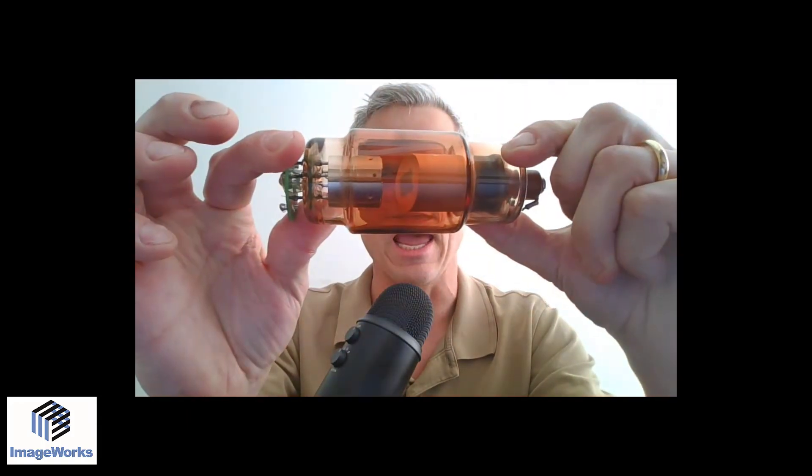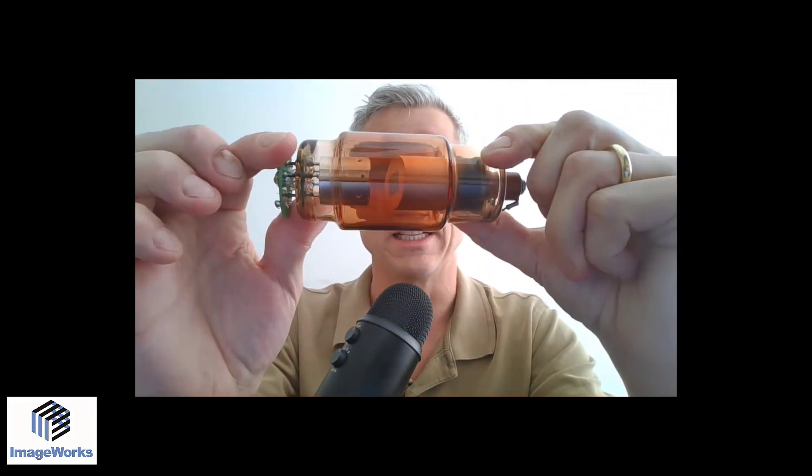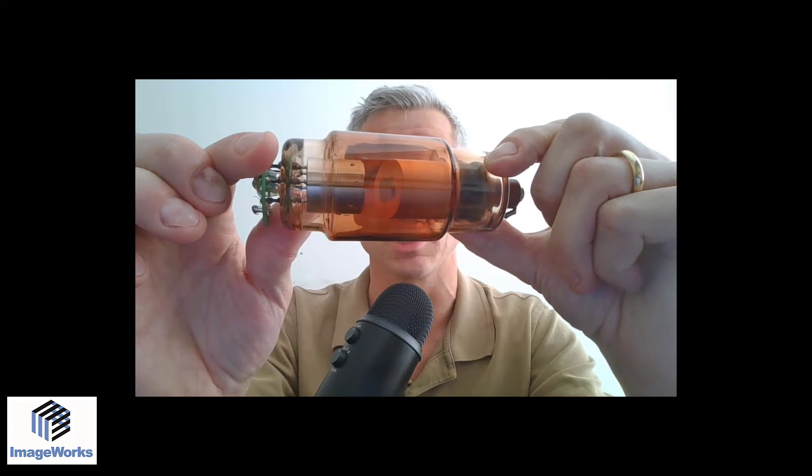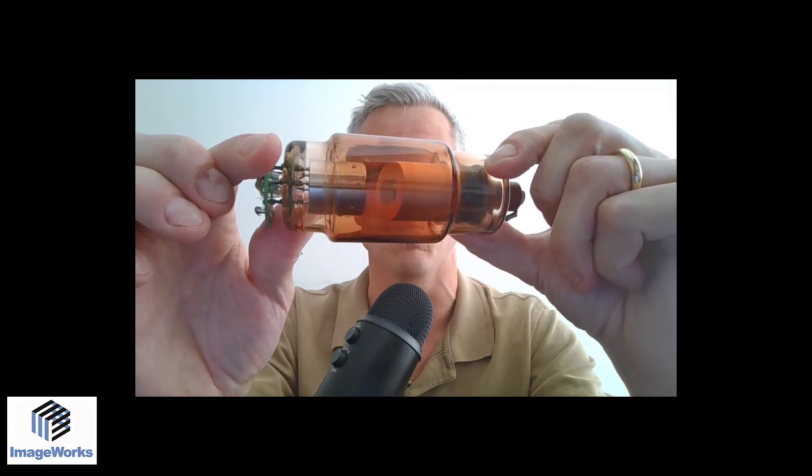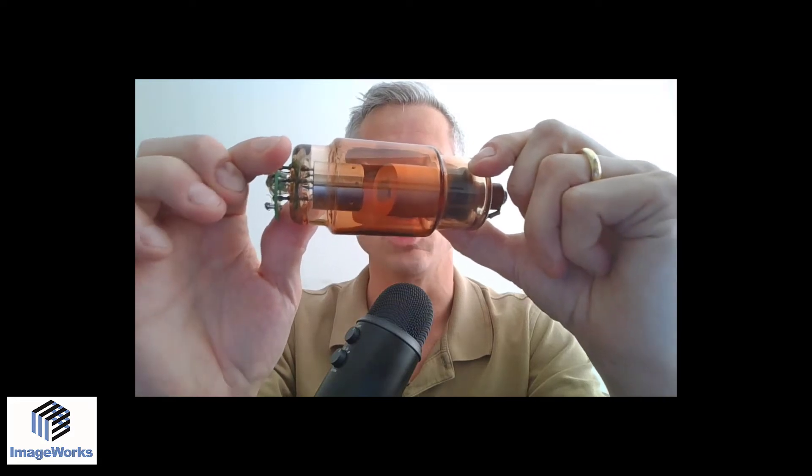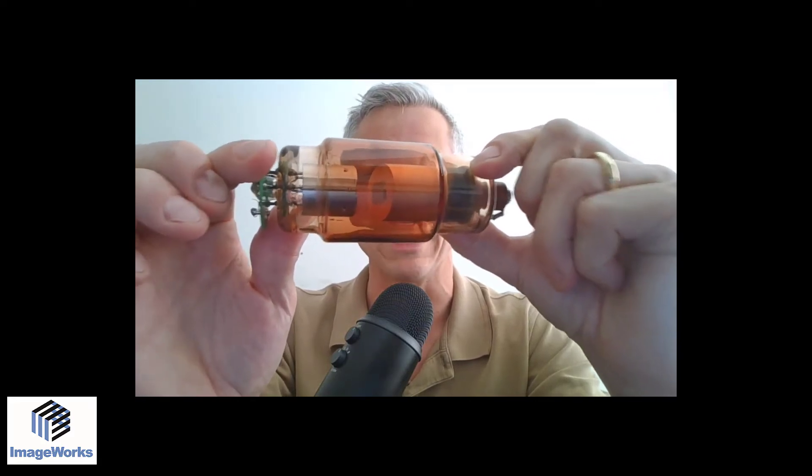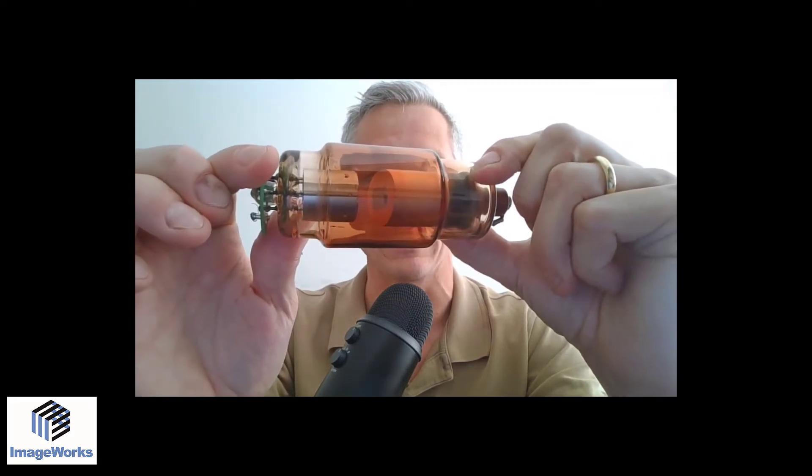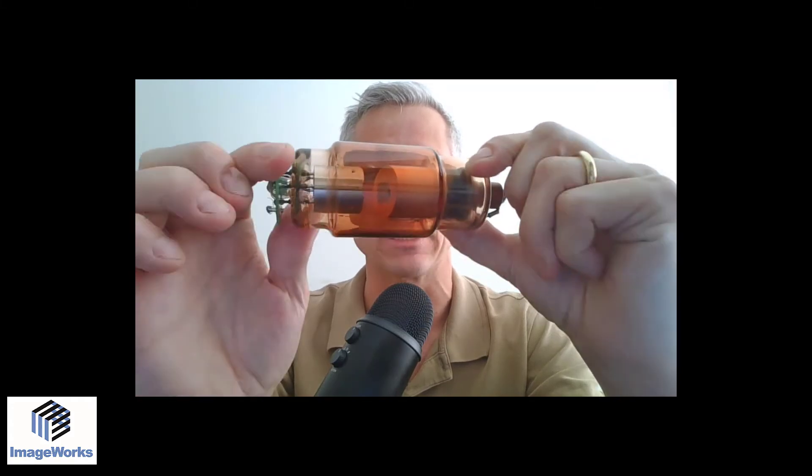So I thought this would be an interesting show and tell. This is actually an x-ray tube from a cone beam system, a system we removed from an office when we put in one of our Xera cone beam systems. I thought this would be a good way to explain what a focal spot is for any dental x-ray and how that can affect image quality.